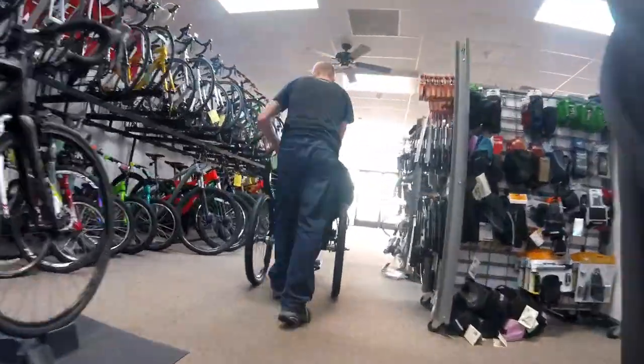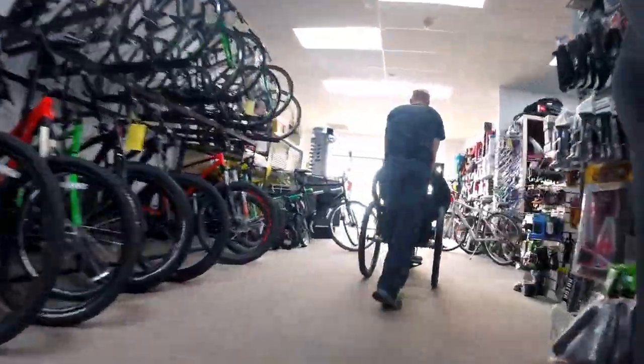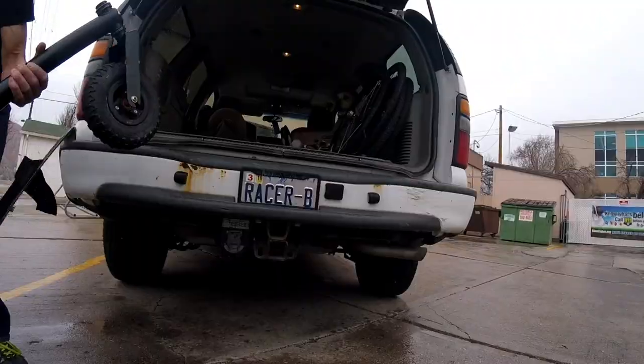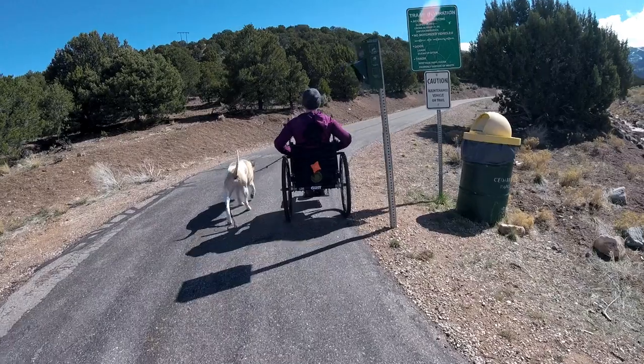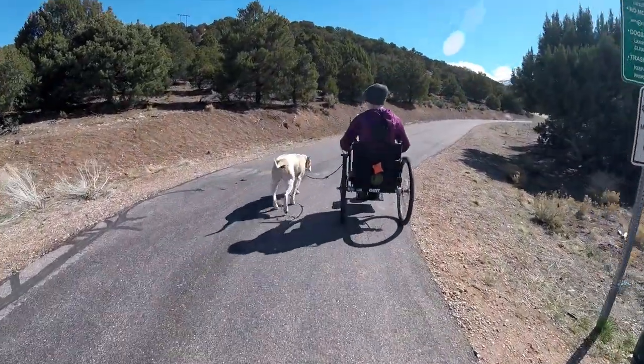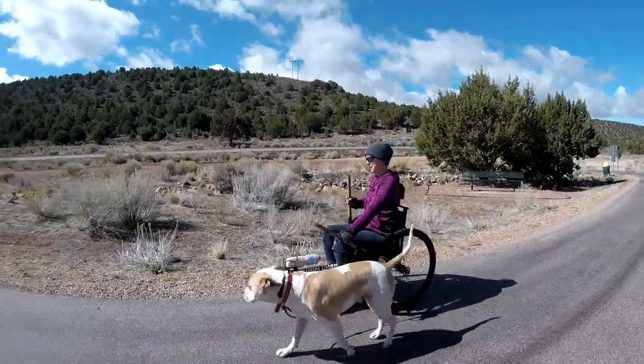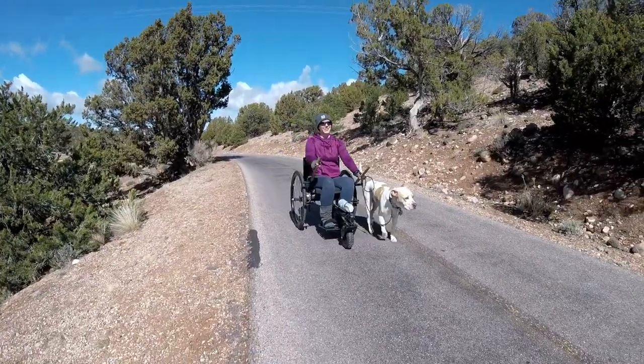Not only was Brian awesome about helping me decide on what I needed and quick about doing the work, but he also helped me take my Freedom Chair out to my car when I came to pick it up. I was really excited to hit the trails after my tune-up, eager to break in my new tires and lever wrap tape. The next day was gorgeous, so we headed to one of my favorite nearby paved trails to test it out — it almost felt like a brand new chair.